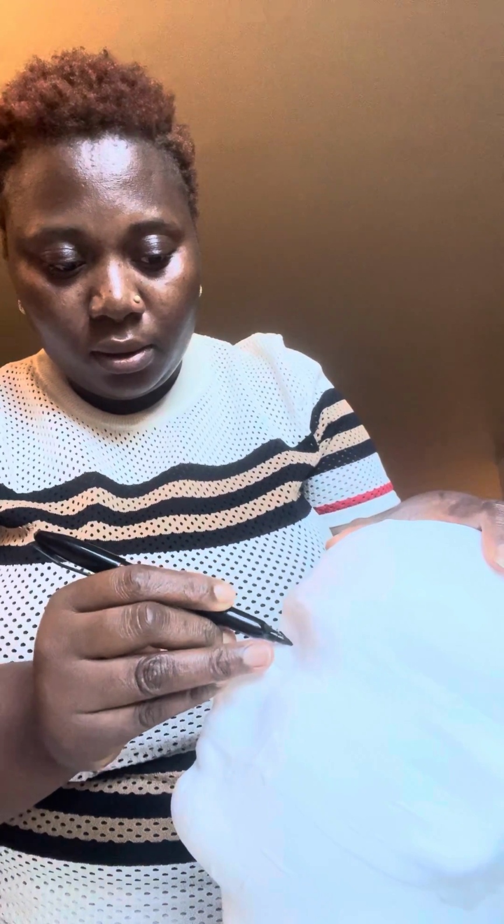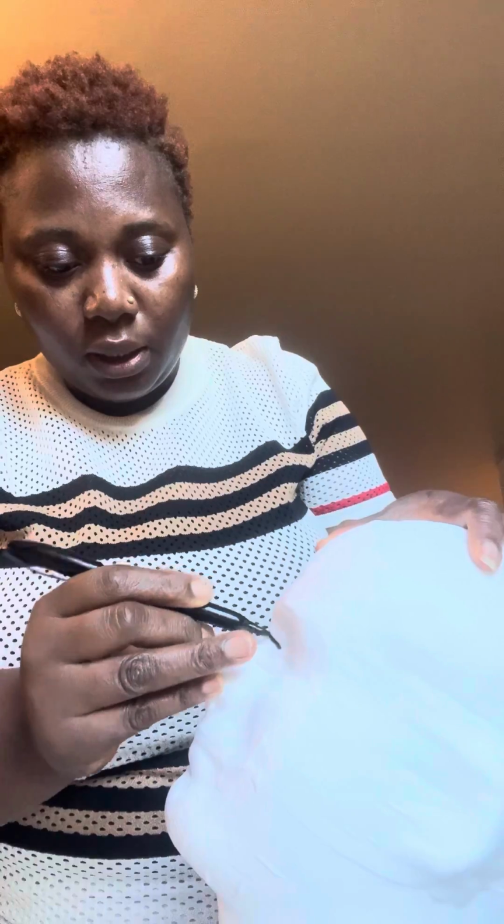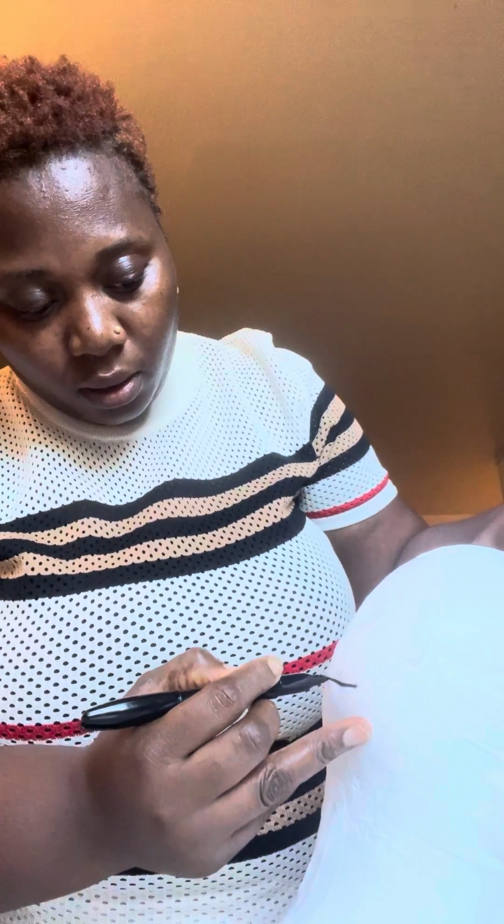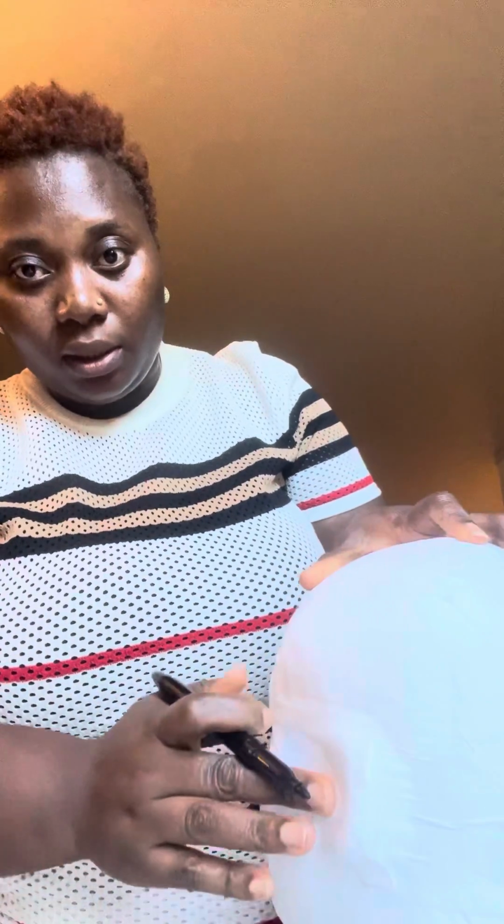Today I'm going to be demonstrating the International 10-20 system measurement in EEG. I'll start with the landmarks, which is the nasion to inion. The inion is the bump at the back of the head. Then preauricular left and preauricular right.